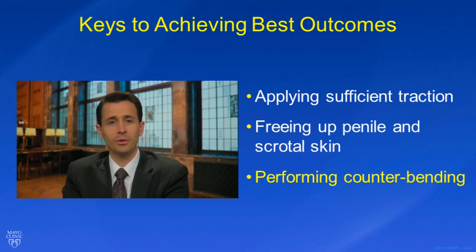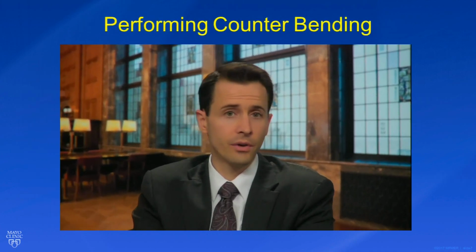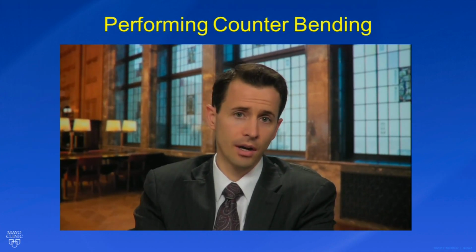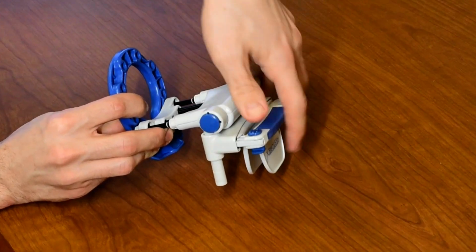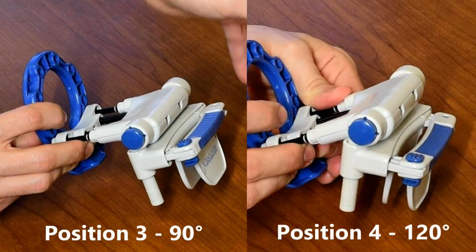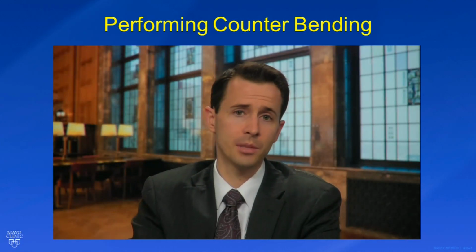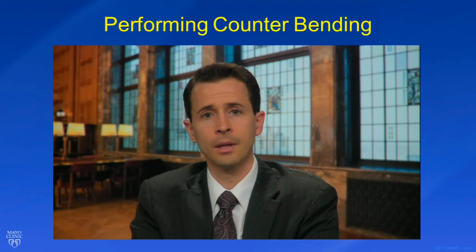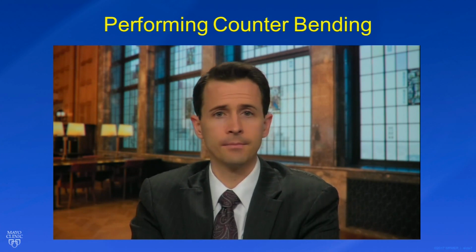Number 3, difficulty achieving counterbending. Many patients struggle at first to achieve counterbending necessary to correct curvature. In our experience, we found that it's necessary to get to position 3 or 4, or in other words, to 90 or 120 degrees in order to experience improvements in curvature. Often this is going to take a little experience and may even take 1 to 2 weeks before you're able to achieve this. There are also some easy tips and tricks you can do that'll make this step easier.